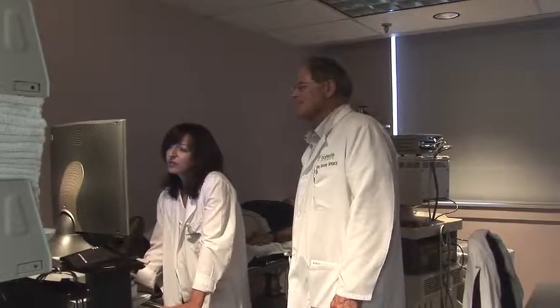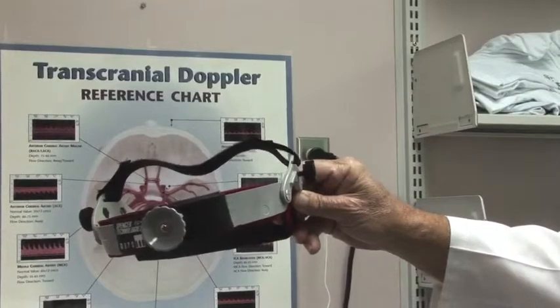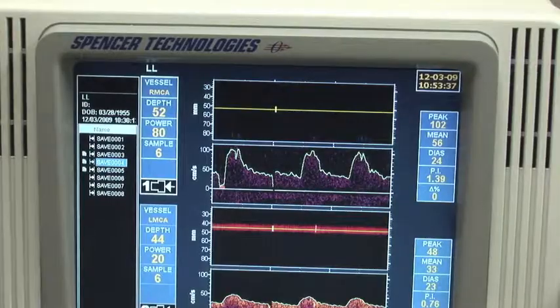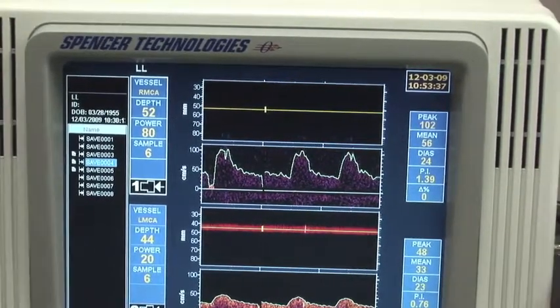And we started in 2005 trying to find ways to identify which patients with asymptomatic stenosis have a high enough risk of stroke or death that they could benefit from stenting or this operation called an endarterectomy. And so in 2005 we showed that if you just put a little helmet on the head and listen for an hour for chunks breaking off the artery, that clearly identified the patients who have a high enough risk that they might benefit from surgery.